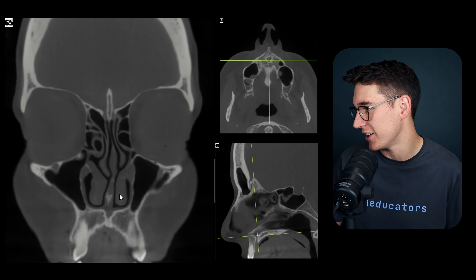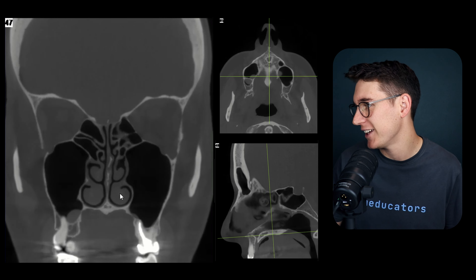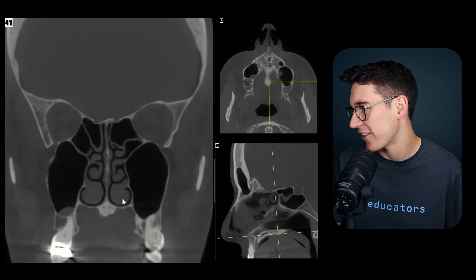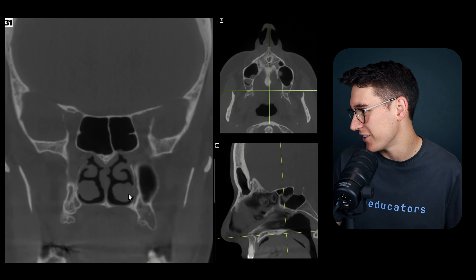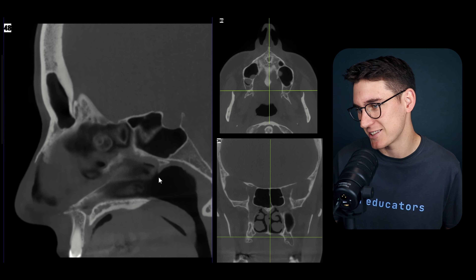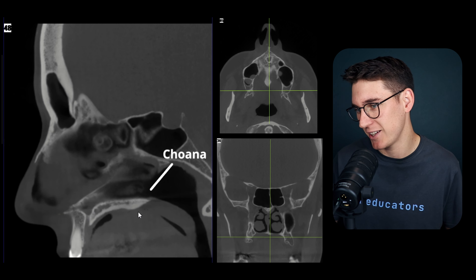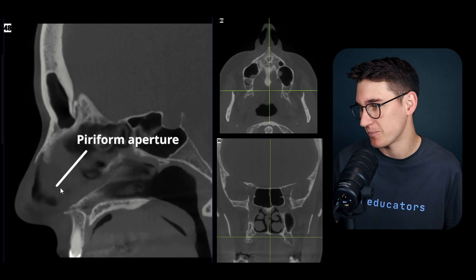Heading posteriorly, we see the posterior opening into the nasopharynx. These posterior openings are what's known as the choanae. We can see on our sagittal view both the choanae posteriorly and the piriform aperture anteriorly.